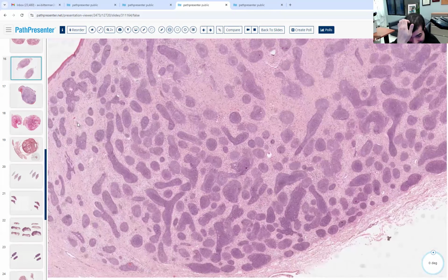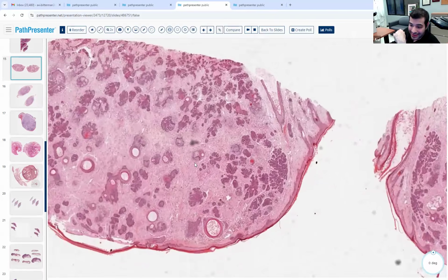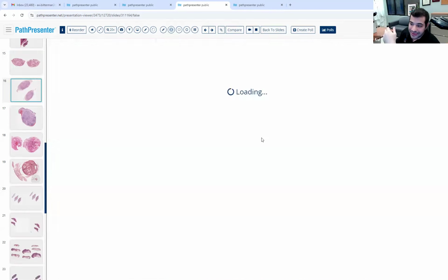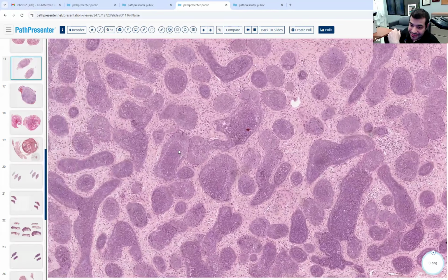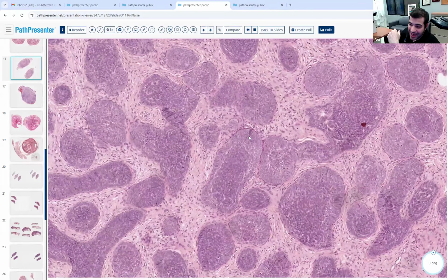So it's similar. Notice that the stroma is quite similar. Both have a fibrous stroma. What's different is the trichoepithelioma is more keratinizing than the trichoblastoma. Trichoblastomas also go a little bit deeper, typically. At least that's the way they like to test them. You can see some areas that it may even resemble.